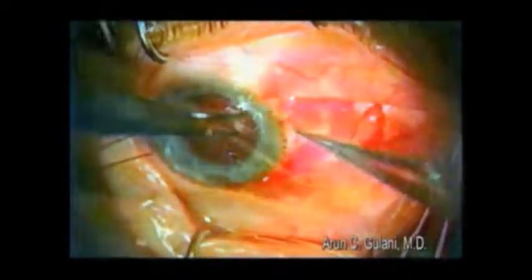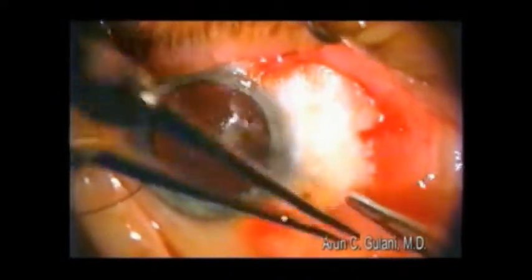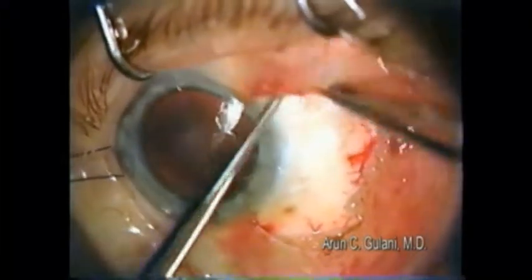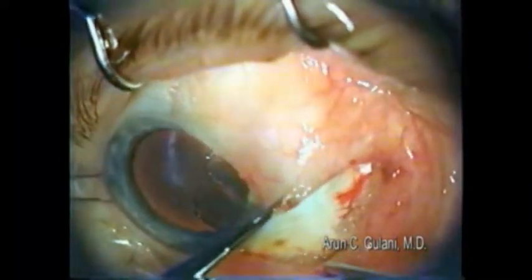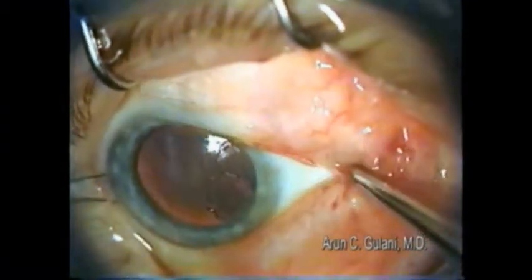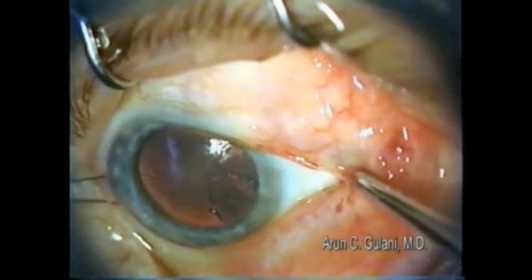This requires meticulous dissection followed by mitomycin C, with pledgets that we place under the conjunctiva and keep in place for about 30 seconds, following which we'll copiously flood this area with balanced salt solution.